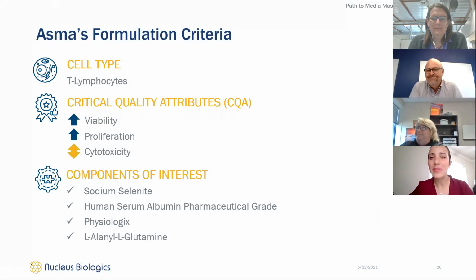Sorry. Thank you, Brad. Thank you, everyone, for joining us. I will start with a quick recapitulation of the main criteria that we selected through MBAir last webinar. The cell type I selected to work on was T cell, and for the CQAs, I selected increase viability, increase proliferation, and maintain cytotoxicity.